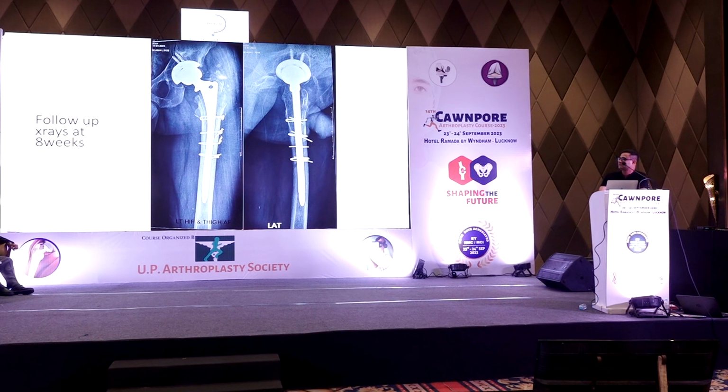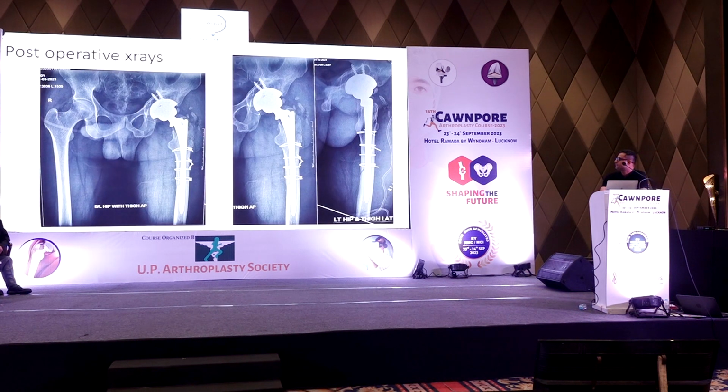So I have the latest X-ray at 8 weeks. It is always advisable, when you're taking an X-ray, especially, to take an X-ray of both hips, because a single hip will not give you an idea of how much, the simple reason being, if you look here.